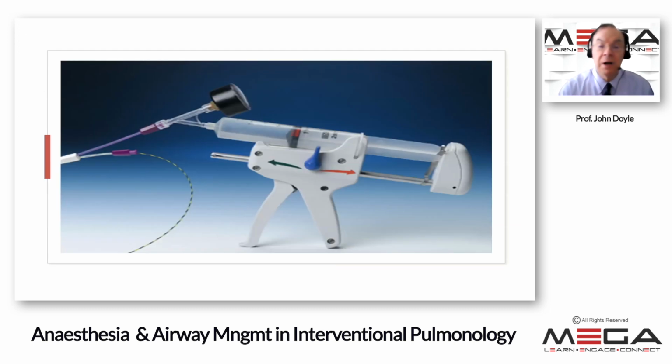Here's an example of one of the balloon dilatation machines that you can get. It is filled with saline, and there's a pressure gauge in black, as you can see there, where you can gauge the pressure, and then it's done for a particular period of time and then removed.